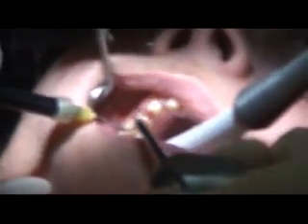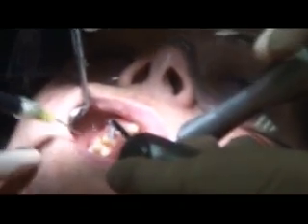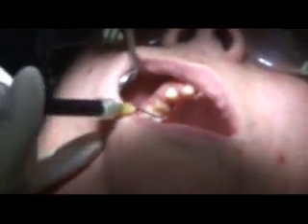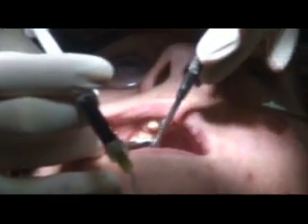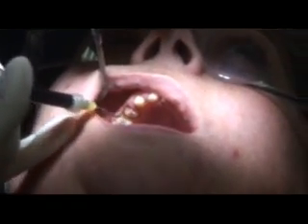And go around. I usually have the assistant rinsing, and if you're doing it yourself, you'll need to stop more often. That's good. And you rinse, and you make sure there's no bleeding in the sulcus anywhere. Then the next key that people don't believe me on, but I'm going to tell you the key, is leave a little layer of Viscostat in there before you pack each cord. Notice that there is no coagulated blood.